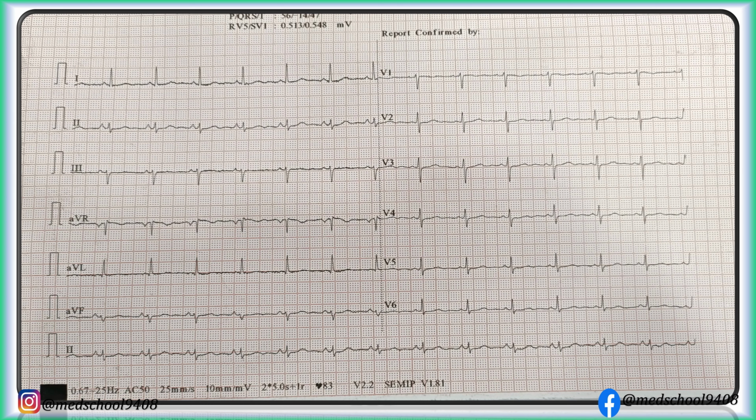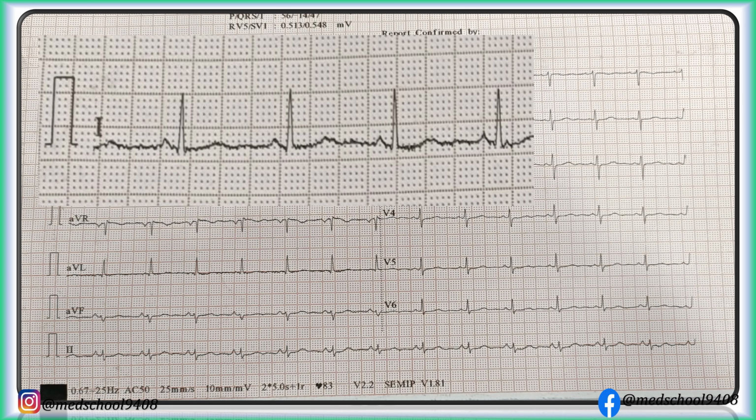Let's determine duration of P wave and amplitude of R wave in lead 1. Here P wave is 2 boxes wide. Therefore, duration of P wave is 2 small boxes, that is 80 milliseconds. R wave is 8 boxes tall. That means amplitude of R wave is 8 small boxes, that is 0.8 millivolt.